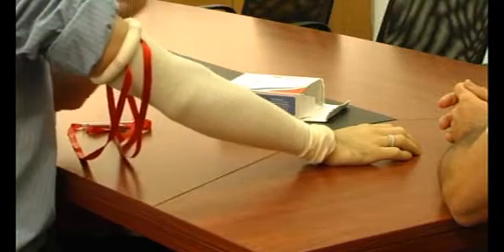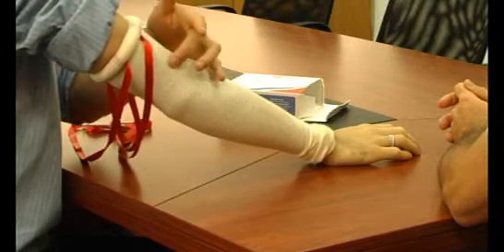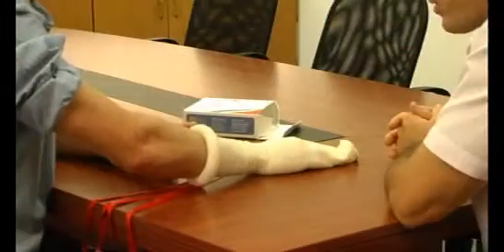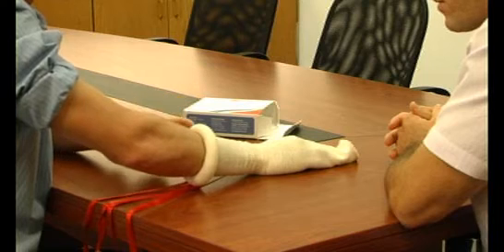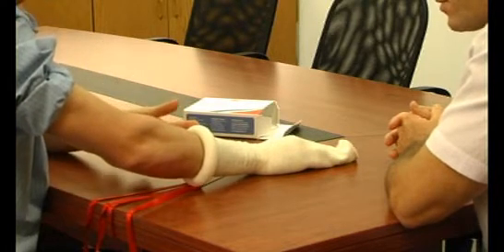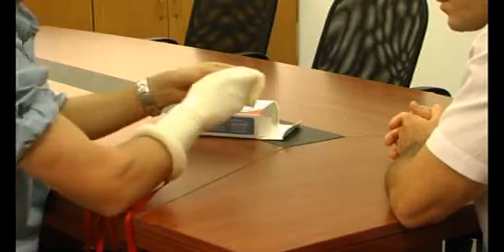You can take it all the way up to the shoulder — you can work on the humerus. The Hemaclear is very flexible. You can position it on the mid-arm to leave less tissue under ischemia. It also applies to the lower extremity. You can apply it on the calf for foot and ankle surgeries — you don't want all of these tissues under ischemia. The Hemaclear comes in four different sizes: upper extremity, lower extremity, small sizes for pediatrics, and extra large for obese patients.